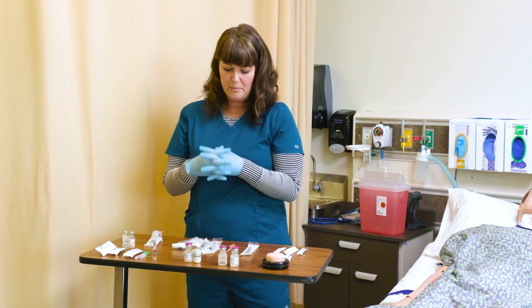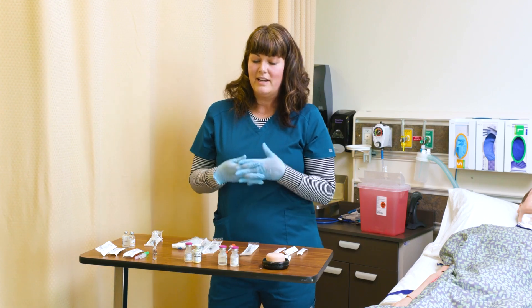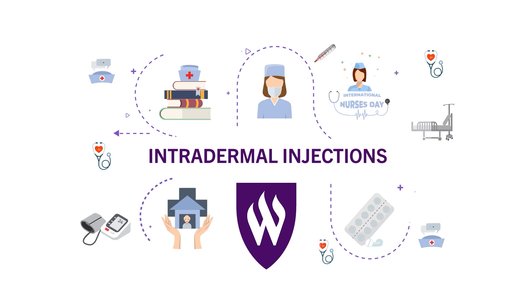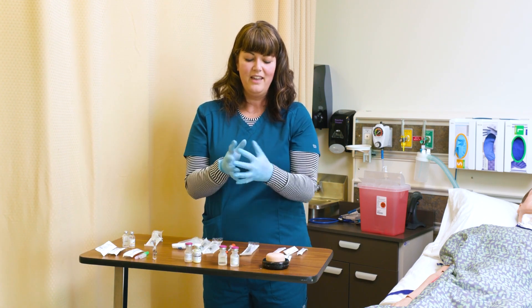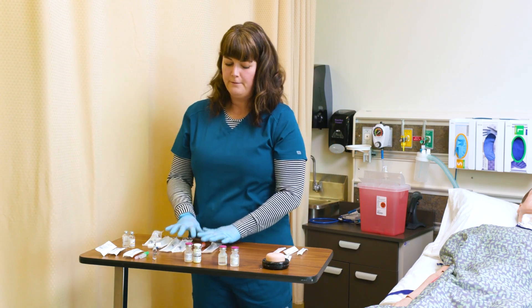Now that we've talked about our different types of syringes and needles, let's talk about an intradermal. You've all had them — they are your TB tests and they go right here in your forearm. Let's demonstrate; it's one of the favorite injections of all nurses, it's kind of fun.